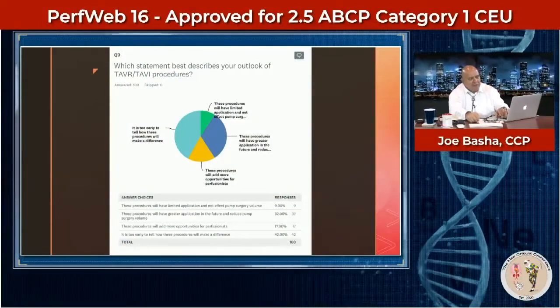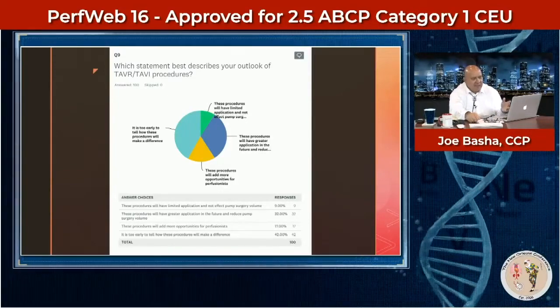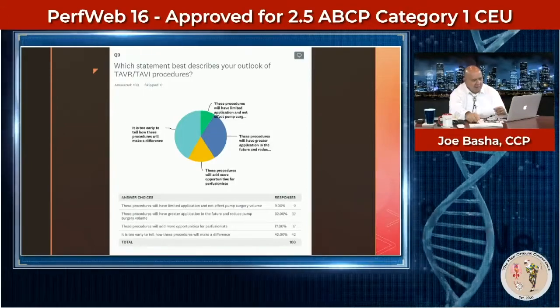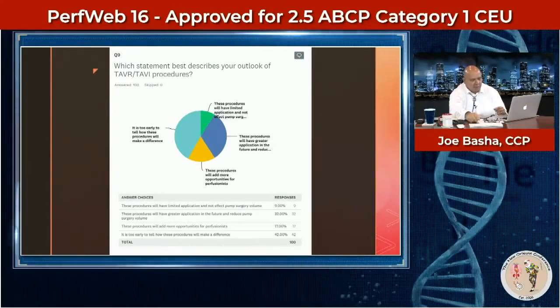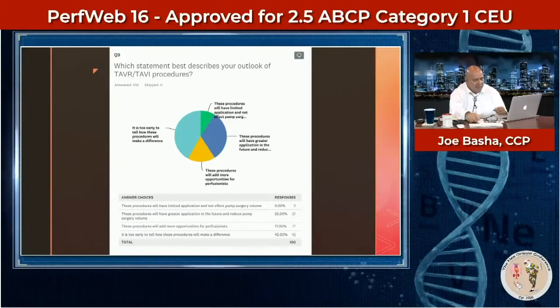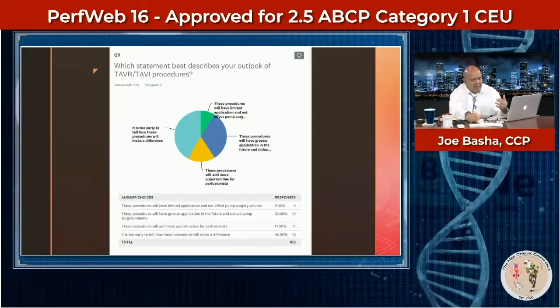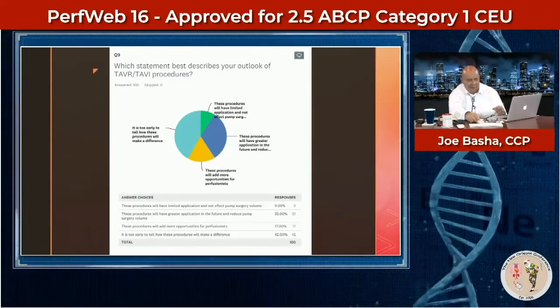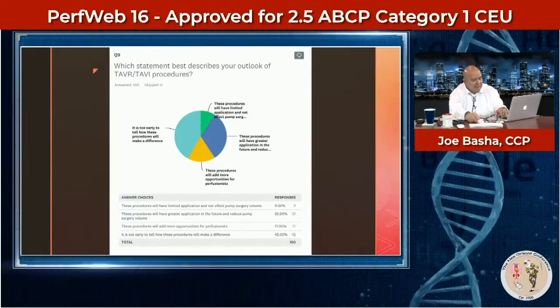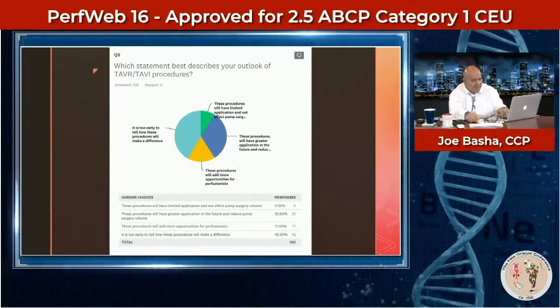And then, what are your responsibilities for TAVR or TAVI standby coverage? This was very good too. Just standing by for pump was 100%, but 43% did intra-aortic balloon pump monitoring, 26% did setup monitoring, which I don't know what that is, and 22% did a TAVR procedure checklist, and 0% prepared the valve, thankfully, because I don't think that's within our scope or purview. But nevertheless, they asked the question. Maybe that's where the new opportunities for perfusionists come in. We can be preparing the valve.